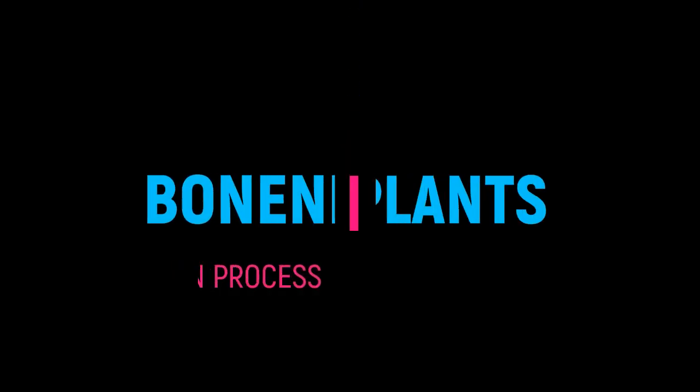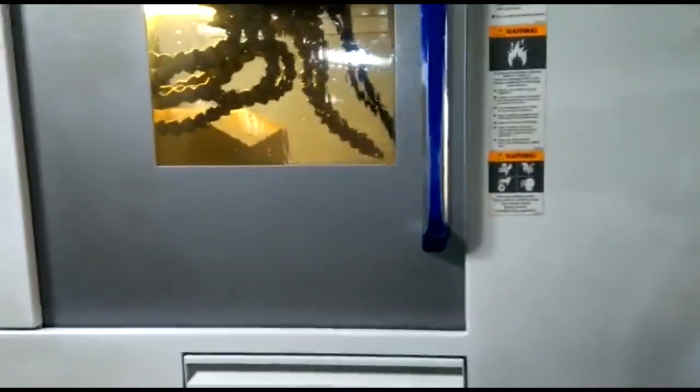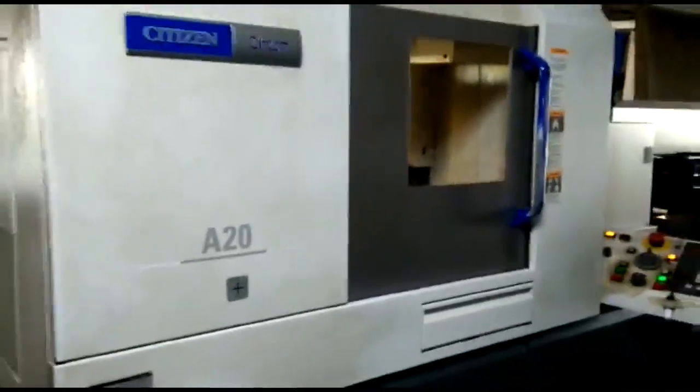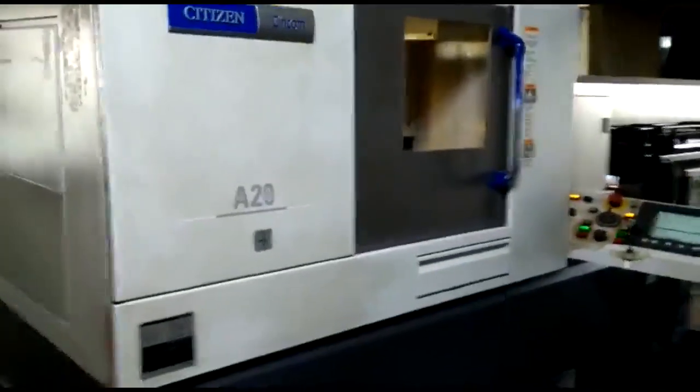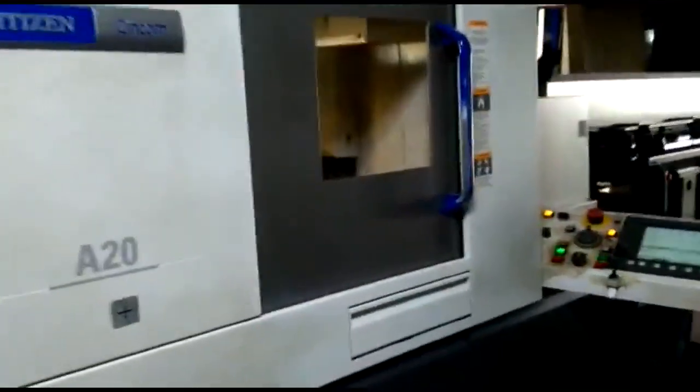Bonenkar implant sterilization process. We manufacture our implants on a sliding head 5-axis CNC machine, Swiss made. Repeatability measured in diameter is 0.005 millimeters. That means our customer will find the same micron precision in every batch. During the machining and polishing process, implants can be contaminated by traces of lubricants, oils, microorganisms, particles and fibers.